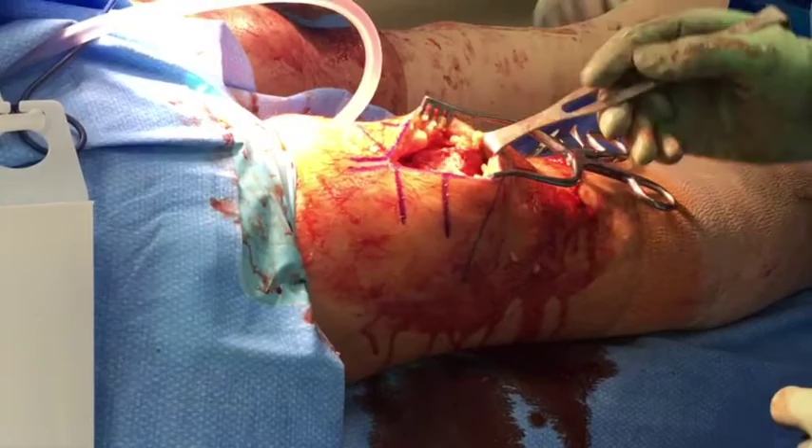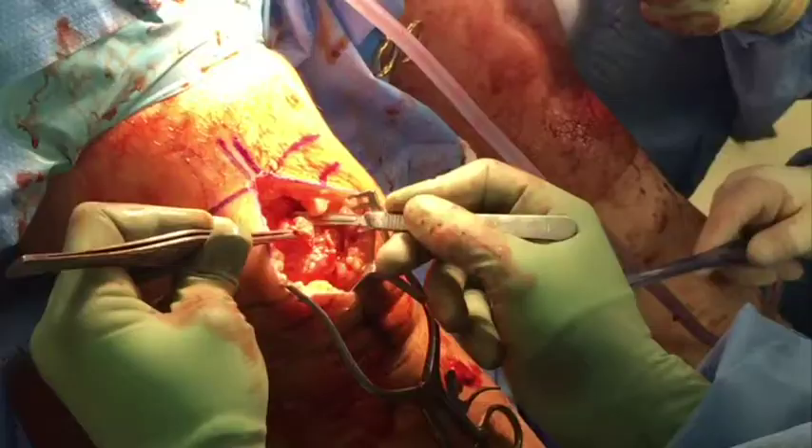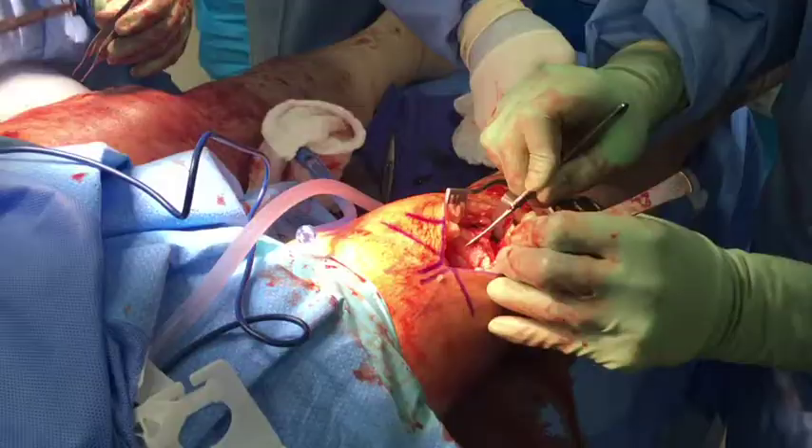An Army-Navy retractor is hooked on the inferior pole of the patella. The superior pole of the patella is then sharply debrided of any remaining tendon stump and the bone is scraped using a knife or a curette.